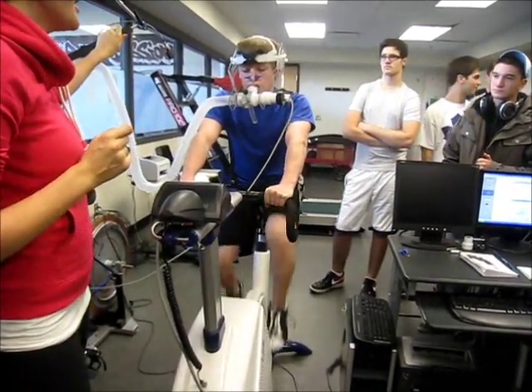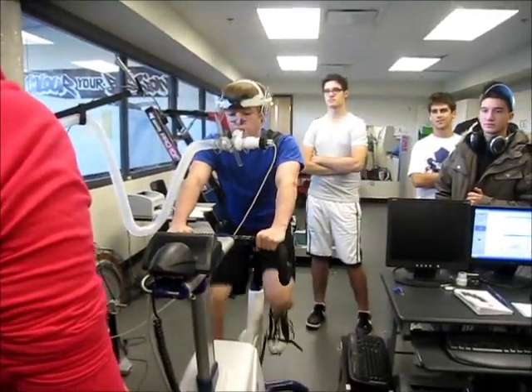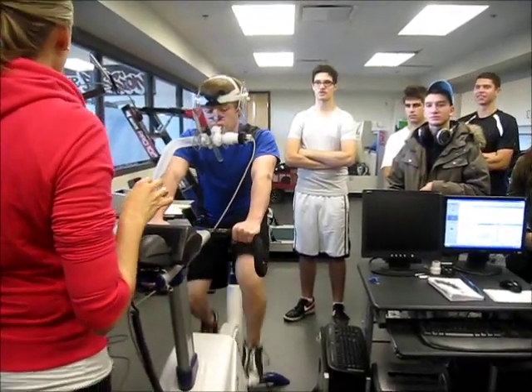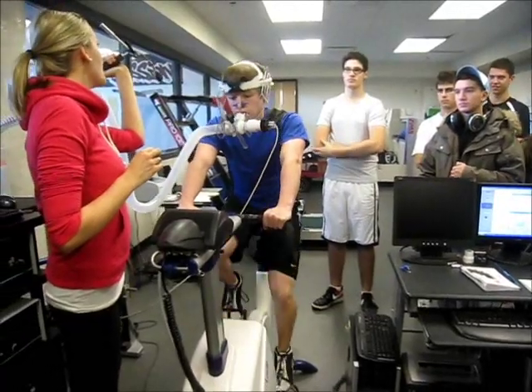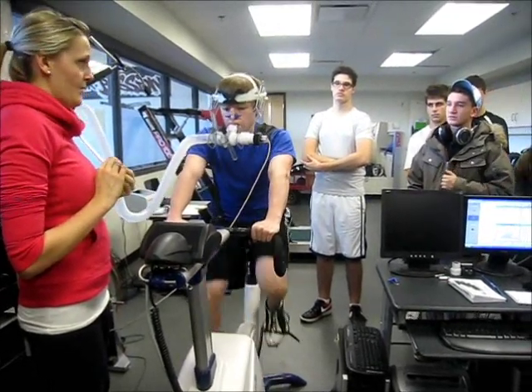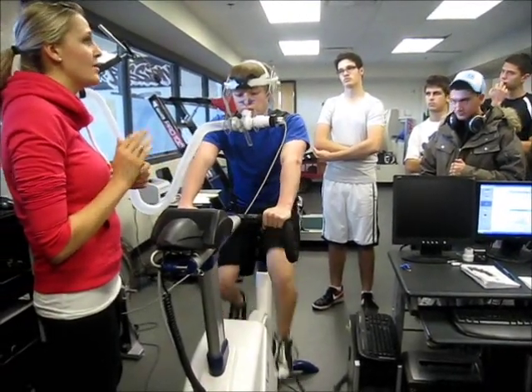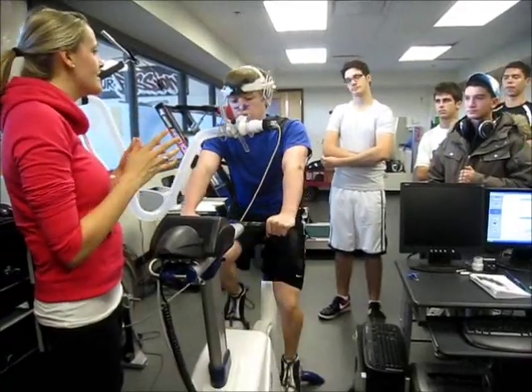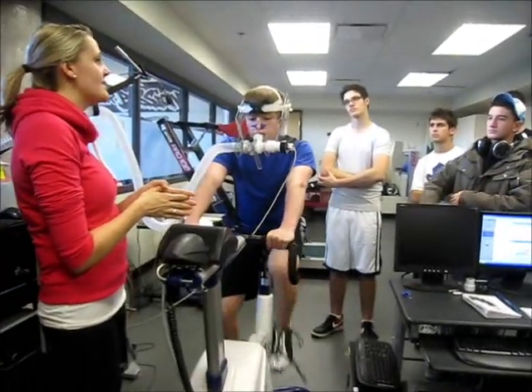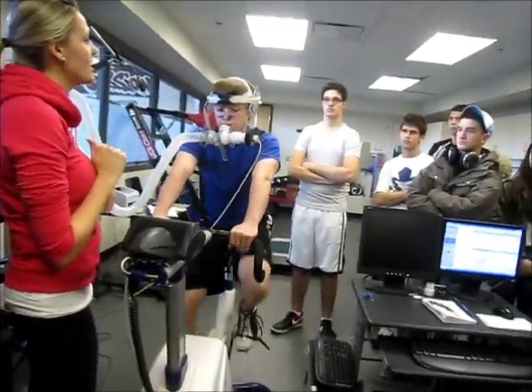So we're over the two-minute mark, so the resistance is going up. Is there like a record for this — someone who's lasted the longest amount of time? The time of the VO2 max test doesn't necessarily mean anything. Two people could both be at eight minutes and one has a VO2 of 50 and another has a VO2 of 40. The highest VO2 I've seen was 72 — when 50 is the 90th percentile — and that was a cross-country athlete.